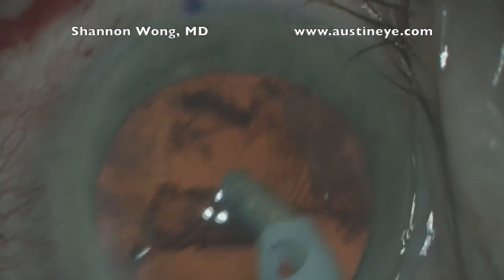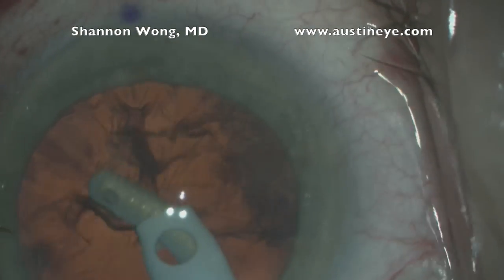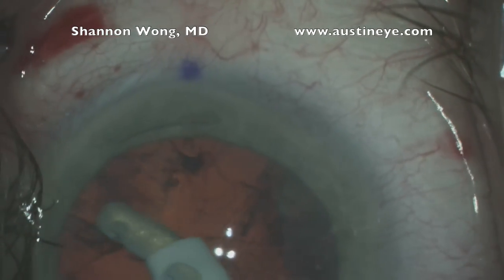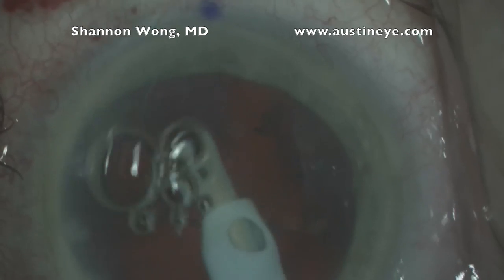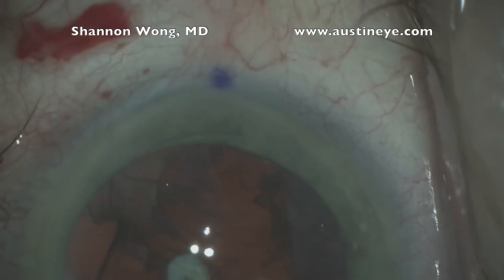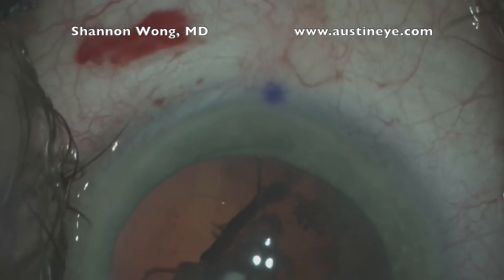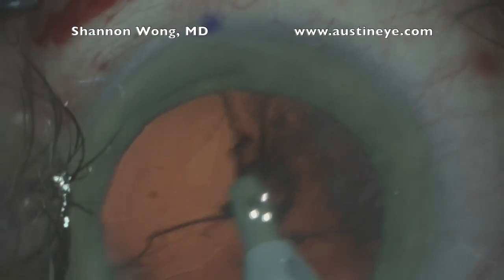When we use irrigation and aspiration we're careful to remove the cortex that is furthest from the anterior capsule defect. As we migrate and remove the cortex that's closest to the anterior capsule defect we're extremely careful and gentle. We want to put as little strain on the area of weakness as possible, and we make sure the capsular bag remains inflated throughout this process by keeping our infusion constantly on through the irrigation and aspiration handpiece.